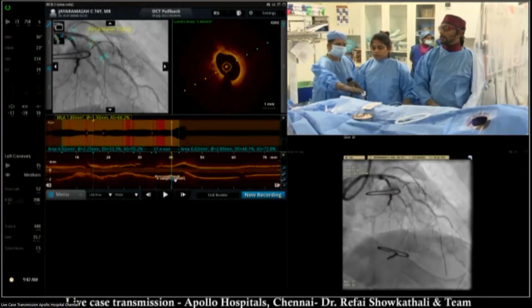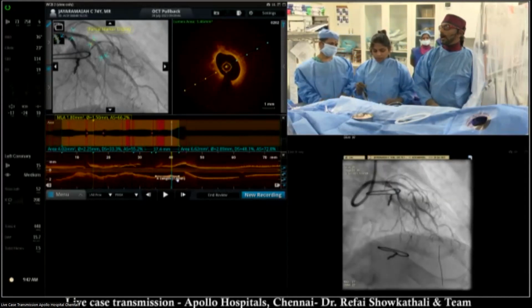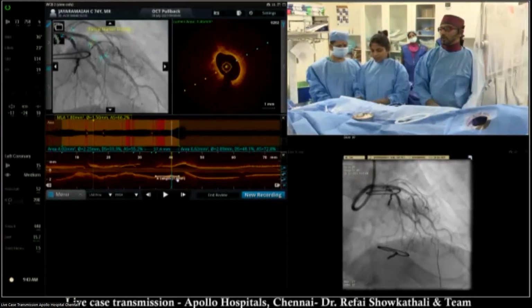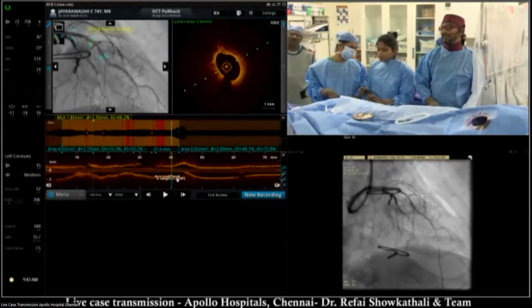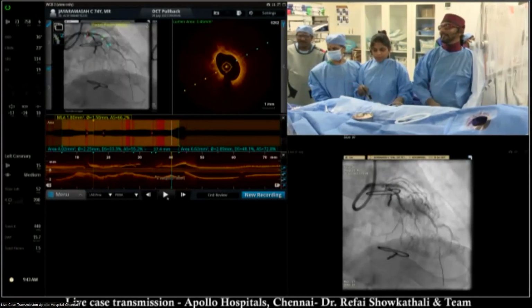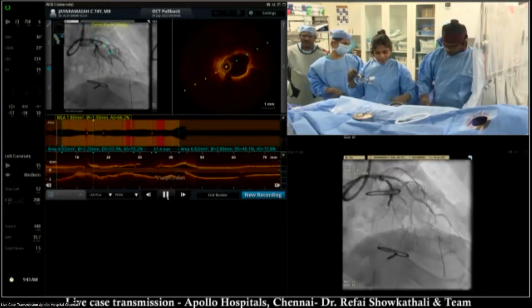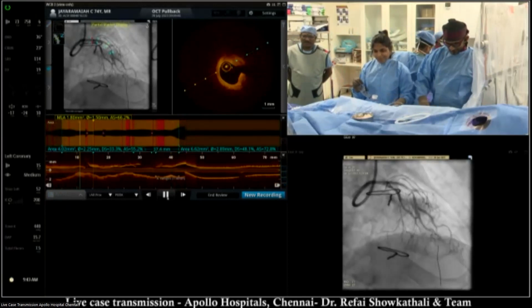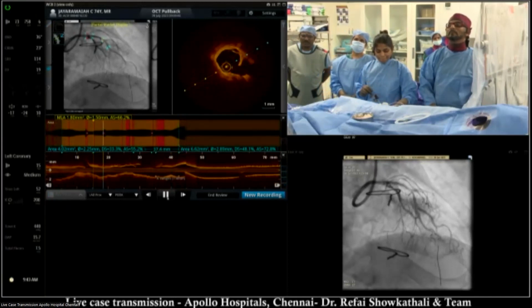But Refai, you told 2.65 is the EEL to EEL size, and how do you take a 2.75 stent? Because my proximal LAD is a decent size. This is a 23 balloon, so I've decided I can even put a small one. You tell that is a fallacy of the interventional therapy recommended by the OCT people. They tell that 0.25 less than the EEL to EEL be the distal stent size. You are telling I will take 0.15 more than the EEL to EEL. Then you are telling that is it acceptable? Actually, by the 2.65, you have to go for 2.5.